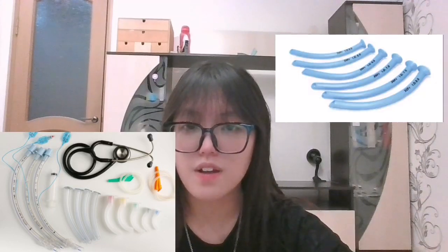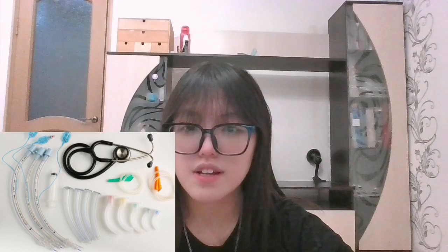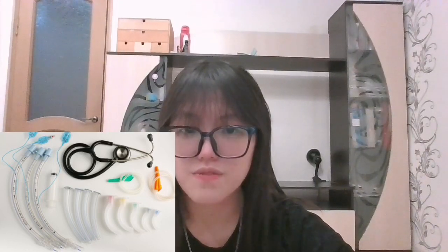Now I will talk about the equipment for the nasopharyngeal airway. First, gloves, mask and gown. Towel sheets, various sizes of nasopharyngeal airways, water-soluble lubricant, suctioning apparatus, and a nasogastric tube to relieve gastric insufflation as needed.